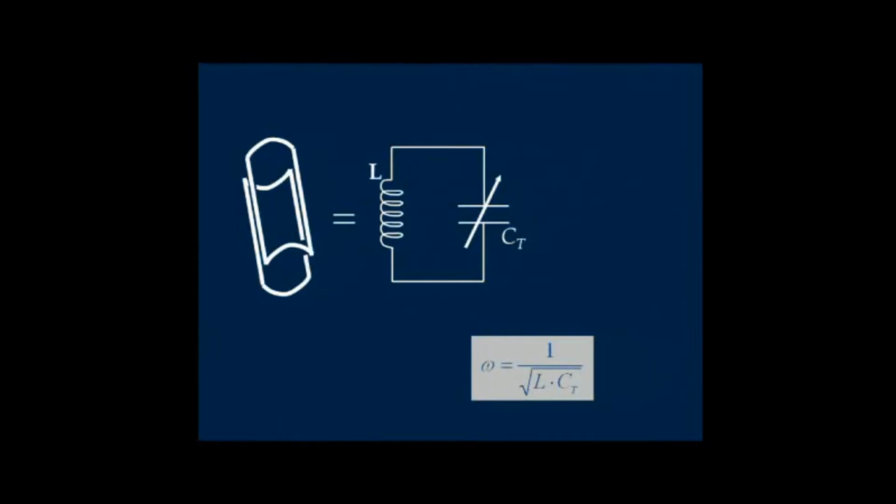This resonance frequency is, of course, dependent on the capacitance and on the inductance, and, which is most important, if this resonance frequency is equal to the Larmor frequency, then you can, via the resonance effect, excite and manipulate the atomic nuclei in an atom. And this is actually quite amazing, I think, because this very, very weak radio frequency energy you put in is able to manipulate atomic nuclei where the forces are very strong. And this only works via resonance.